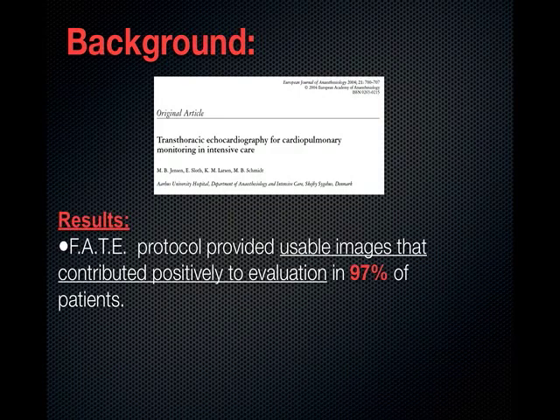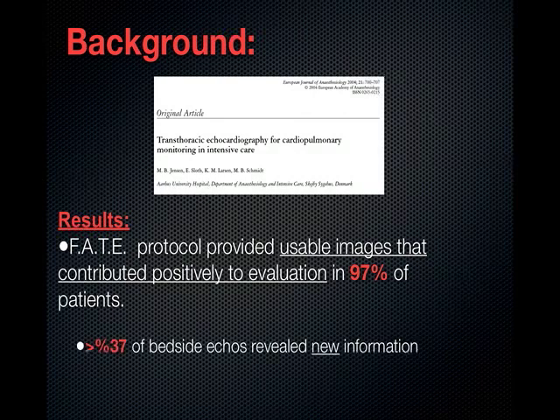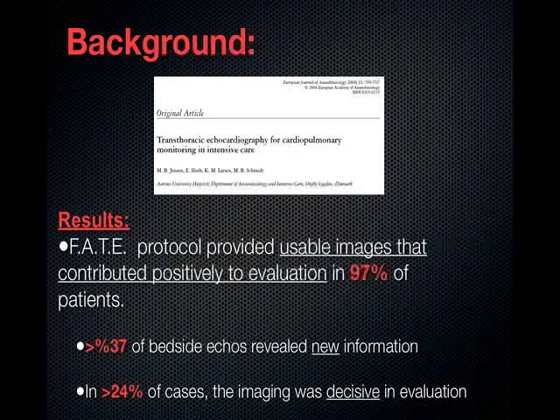And the results of this showed that the FATE protocol provided usable images that contributed positively to evaluation in 97% of patients. More than a third of bedside echoes revealed new information that was not suspected prior to approaching the patient. And in about a quarter of the cases, the imaging was decisive in evaluation. When you're at that fork in the road about what to do with a patient, these images helped decide which way to take the therapy.